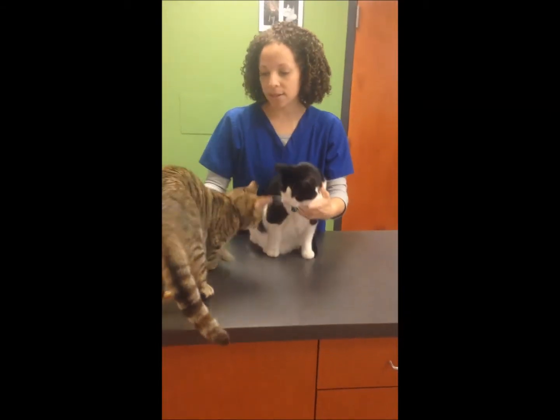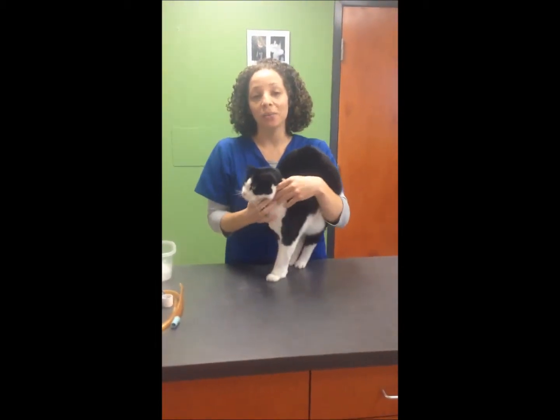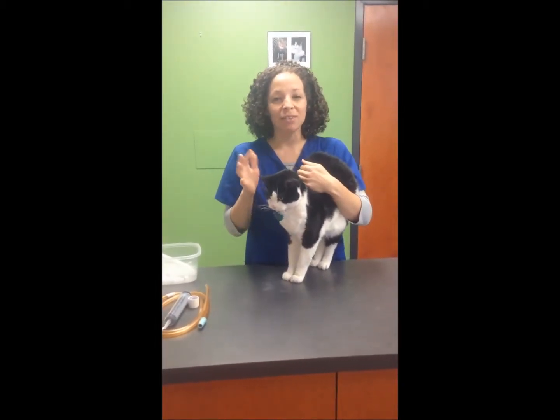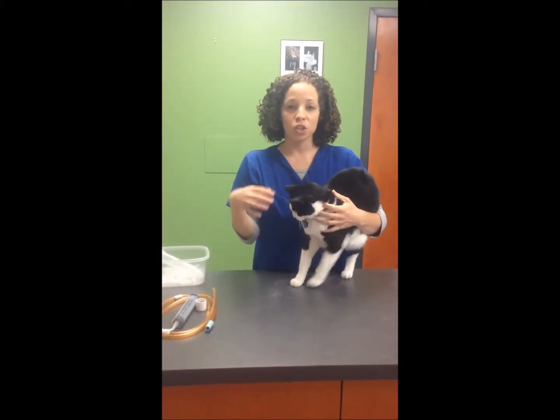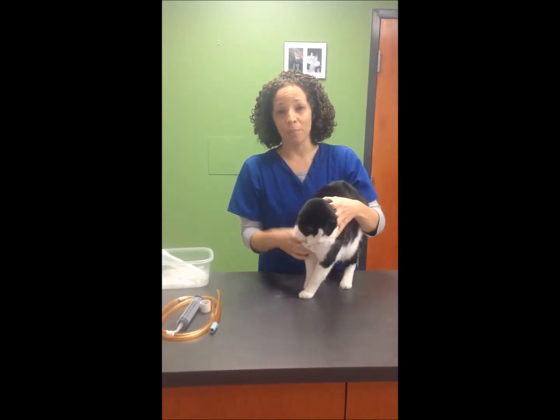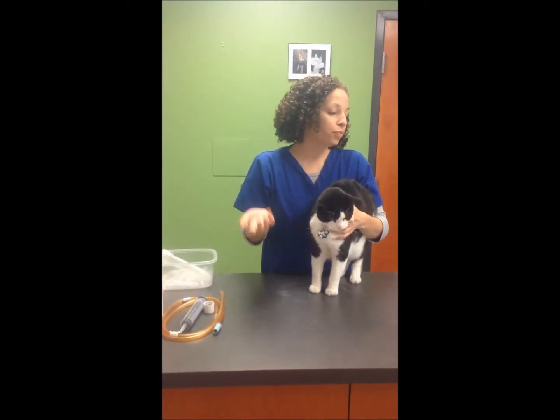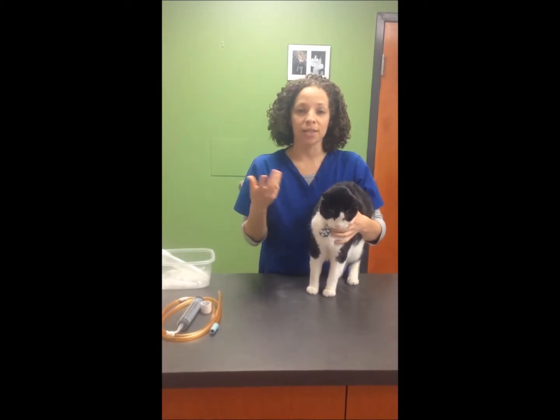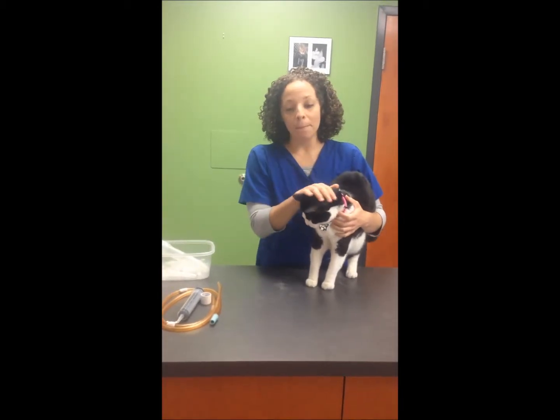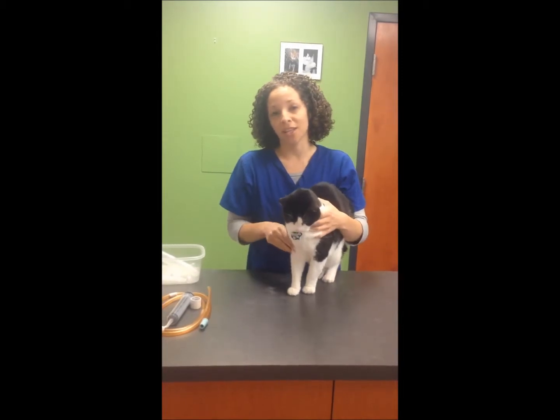Oftentimes with studies like this, general anesthesia or tranquilization would be inadvisable, just because a lot of different anesthetic agents can actually slow your GI transit and motility, which would affect the results of your study. So although taking this many radiographs as are required for these kinds of studies, some patients won't necessarily tolerate it. But again, if you're able to proceed without general anesthesia or tranquilization, that's ideal.